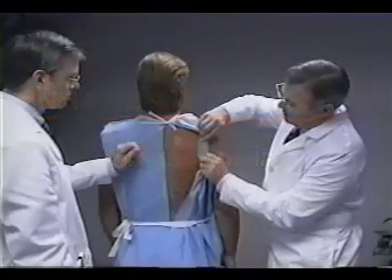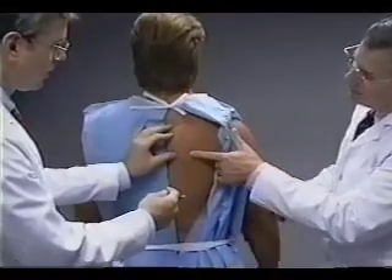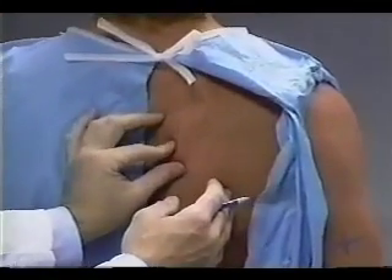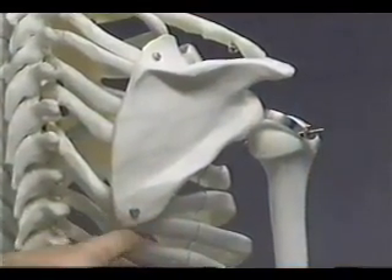The subscapular skin fold is measured with the subject standing upright, shoulders relaxed, and arms hanging loosely at the sides. The technician stands behind and gently palpates the inferior angle of the right scapula, which is to say the lowermost tip of the triangular bone.